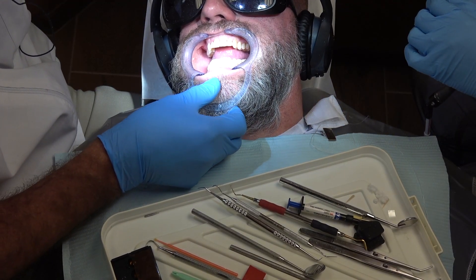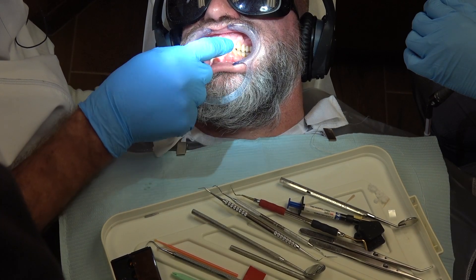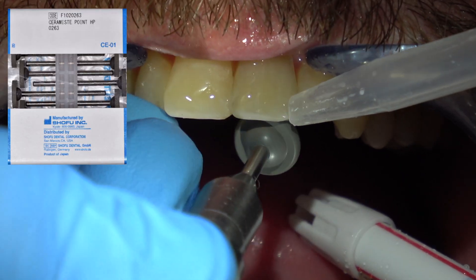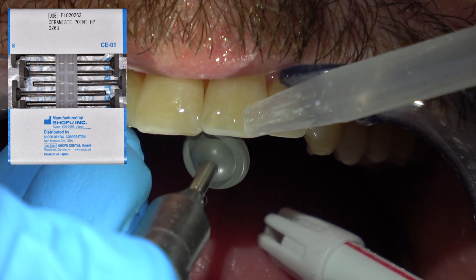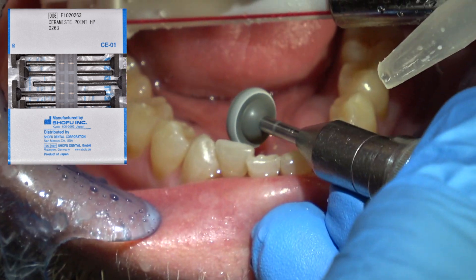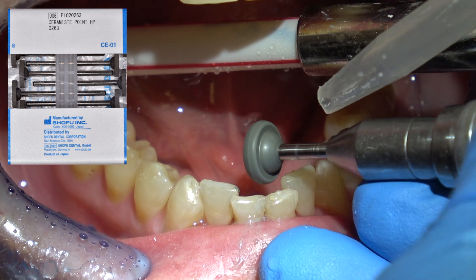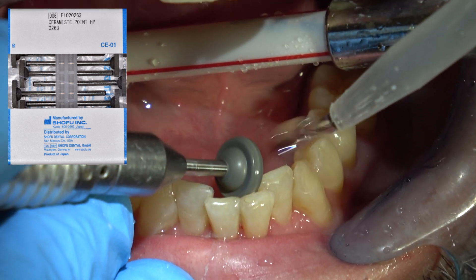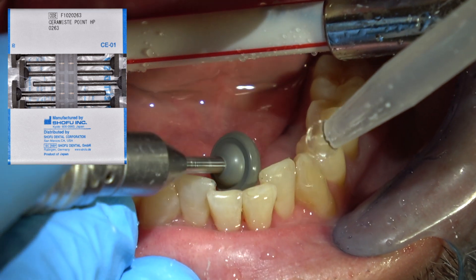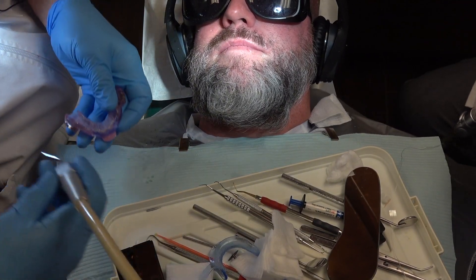How does your bite feel when you bite your teeth together, Charlie? Does that feel tall at all on the front teeth, or does that feel normal? Now, this is a Shofu rubber wheel — this is great for the palatal or lingual edges because it doesn't cut tooth. It really polishes that incisal palatal edge or the incisal lingual edge. How does that feel when you bite together? Pretty normal.